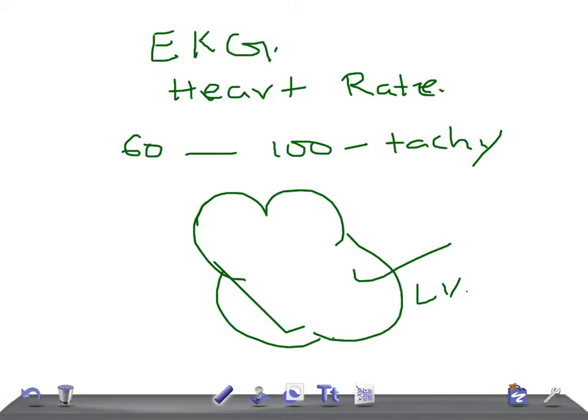Now on EKG, the depolarization of the ventricles, you know very well what wave it produces. Tell me, that's the basic question. If there is a ventricular depolarization, what is the event that is formed on the EKG strip? It's nothing but the QRS complex. Ventricular depolarization forms the QRS complex on EKG, right, guys? So this is really very important.